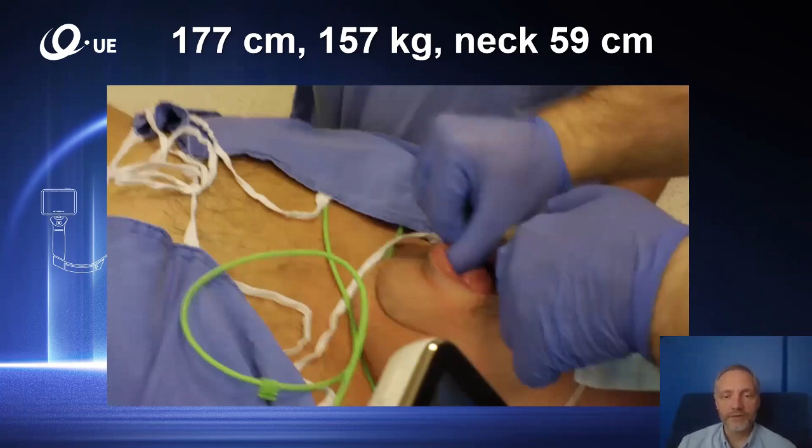although the insertion was a little bit longer than in a non-obese patient because of limited space in the mouth of the patient, this is a good example of what I said about the diameter of the blade. If the blade is thinner, with a smaller diameter, it's easier to insert it into the mouth of the patient.